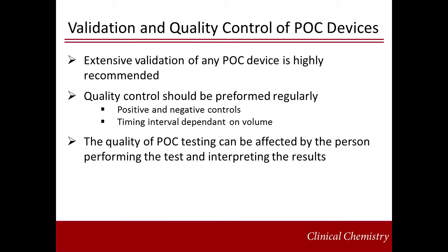Validation of point-of-care instruments is a critical component of a successful POC implementation. The most important components of a validation are precision, accuracy, and method comparison. The method comparison component is extremely valuable. Physicians in the laboratory must be able to identify how or if the point-of-care results will differ from the results derived from the automated instrumentation in the central laboratory.